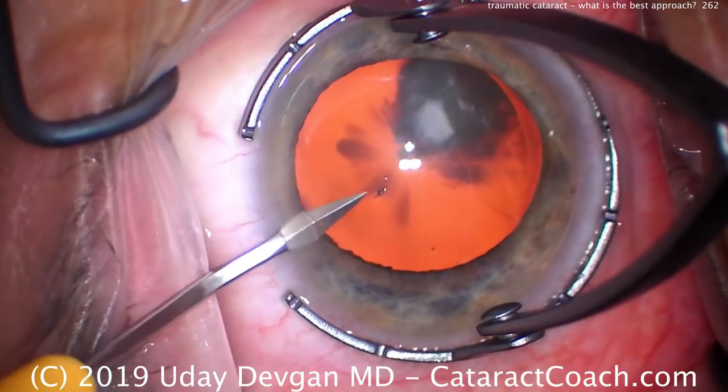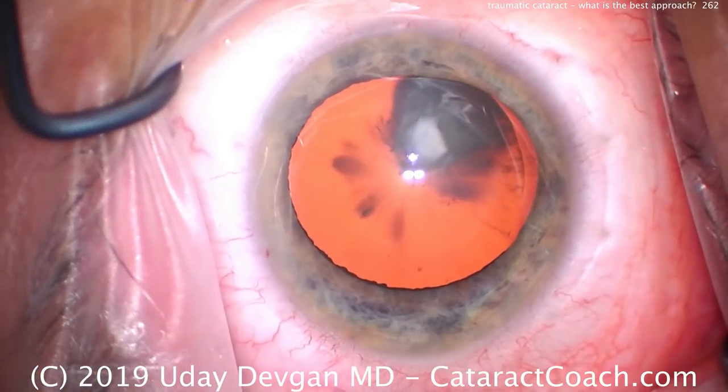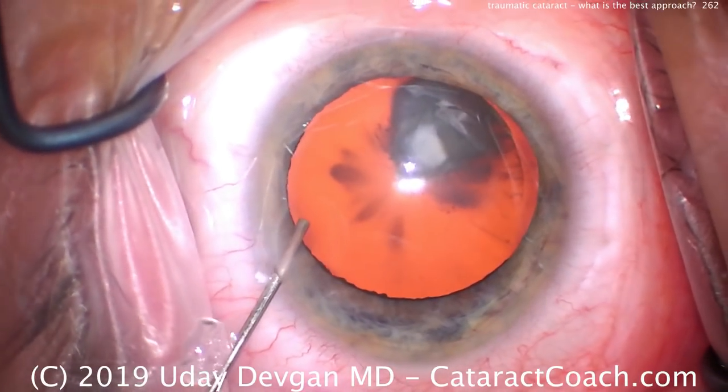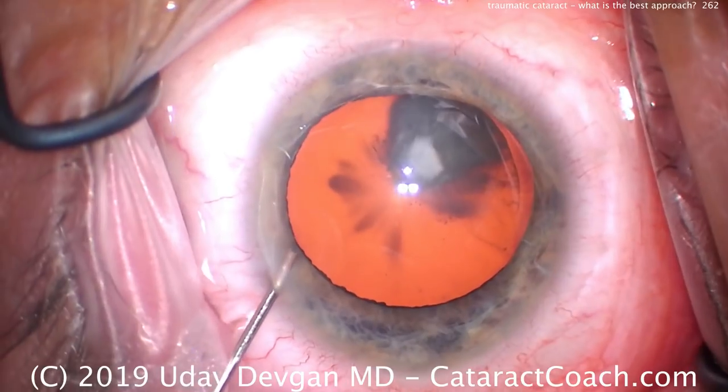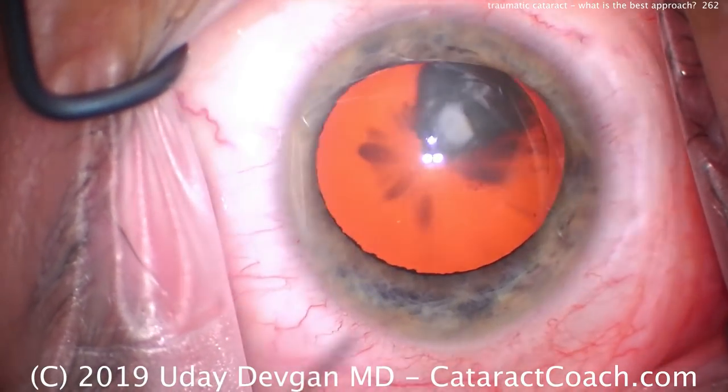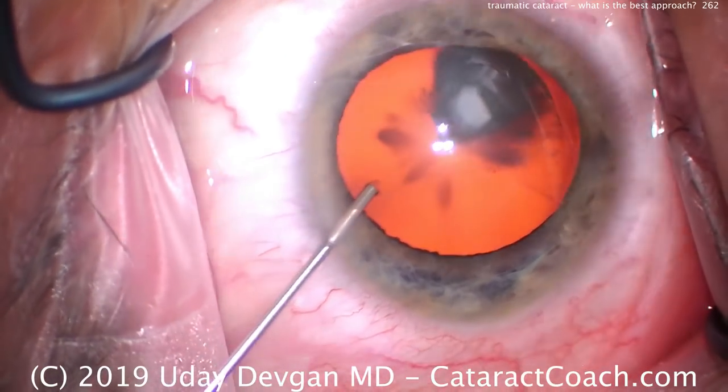With this traumatic cataract, what's the best approach? So let's start off making the paracentesis. As you fill the eye with anesthetic, look carefully. Does the lens move at all? Is there any laxity there in the zonular support? Looks okay. Now let's go on with our viscoelastic or dispersive here and fill up the eye.